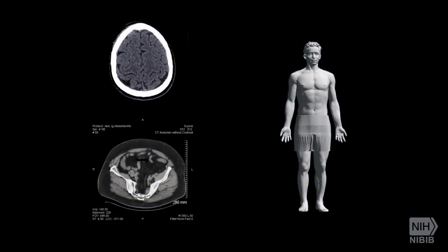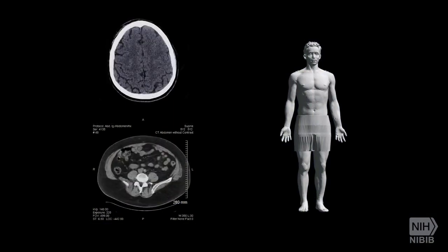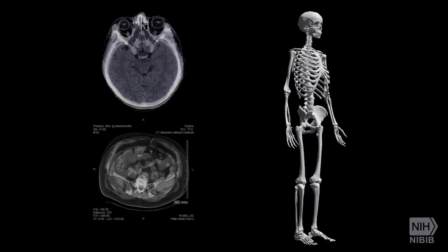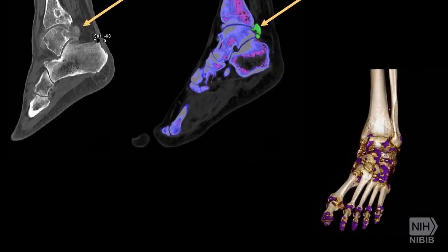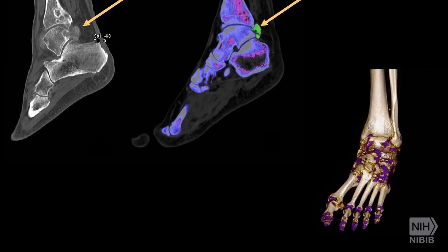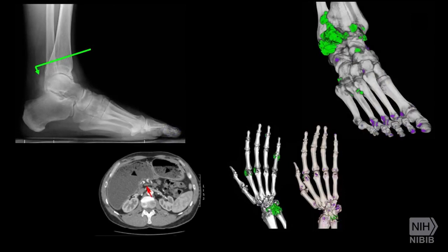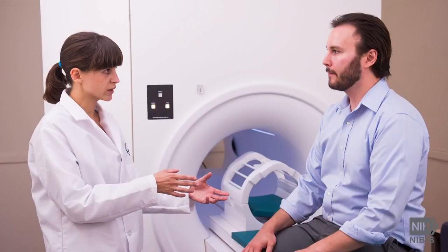High-resolution images of brain slices appear on the left alongside the 3D patient on the right. Image slices can either be displayed individually in two-dimensional form, or stacked together to generate a three-dimensional image that can reveal abnormal structures. Three CT images of a foot are shown. 2D CT images are compared to 3D CT images that show abnormalities, and can help the physician plan and monitor treatments.